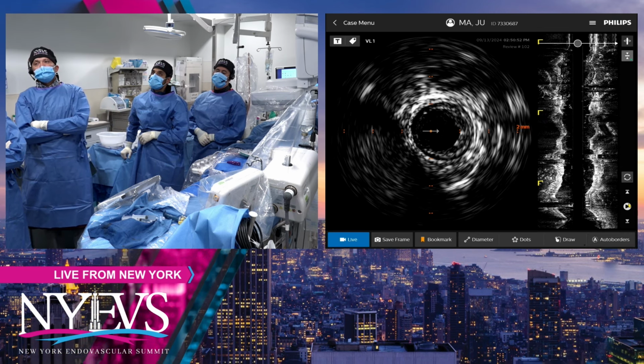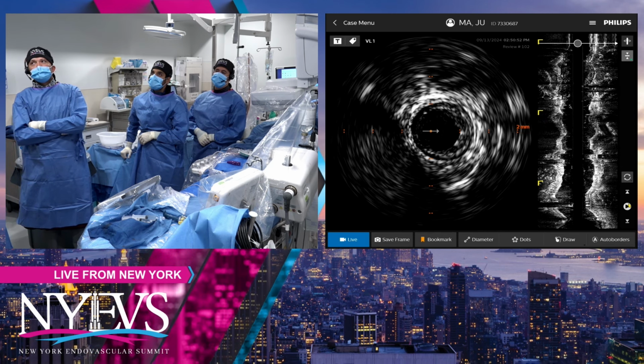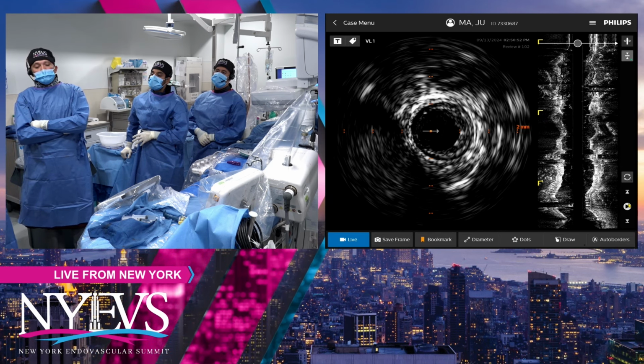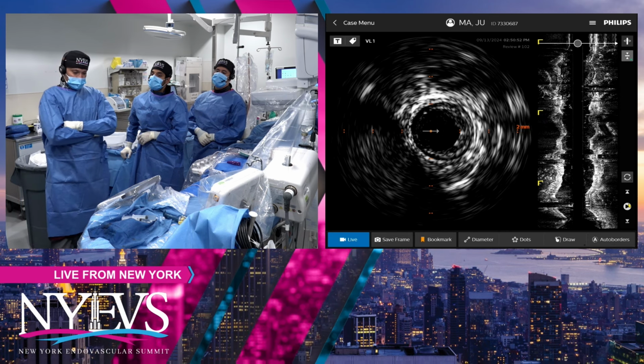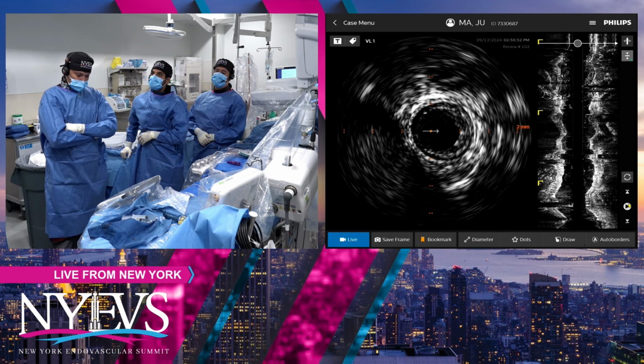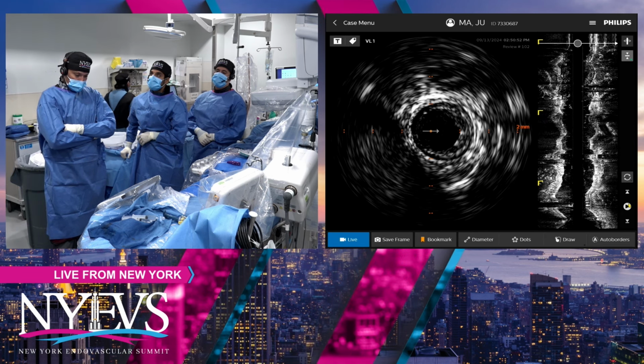We use it exclusively in total occlusions. Right. Yeah. Because with total occlusions, there's an automatic protection at the bottom, and hence we don't use a filter because you think? Not essentially.